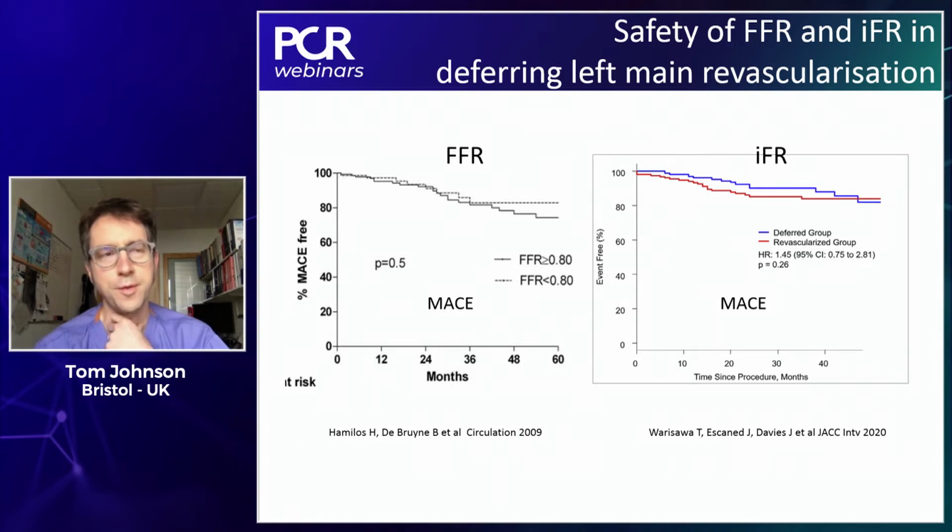So I think we'd have to take that looking at a specific lesion. I think the difficulty would be, why have you taken both modalities? Why have you taken the pressure wire and the IVUS? And I think what Javier has outlined is that where we're trying to make a decision about the significance of the lesion, then using the physiology is probably the right way.